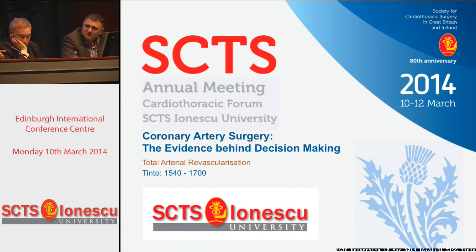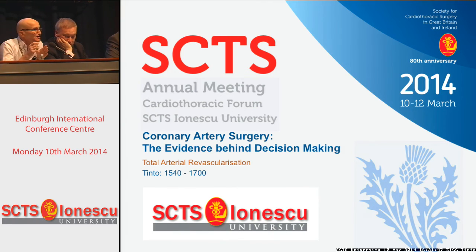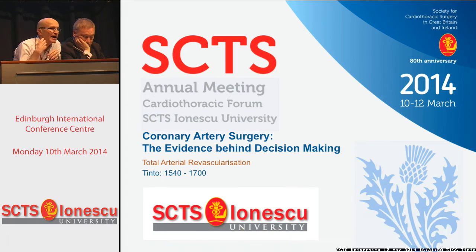One of the points I would make about this is, if you think about it, an interventional cardiologist who does something without any of the degree of complexity that we do will always image his result to make sure he's achieved what he set off to do. And if you bear in mind the one thing you do to change a patient's life expectancy, if a patient leaves your operating room with a patent internal mammary artery to the left anterior descending, you've changed their long-term prognosis. And if you look in the literature, we know that around 3 to 4% of IMA grafts are blocked when the patient leaves the operating room.